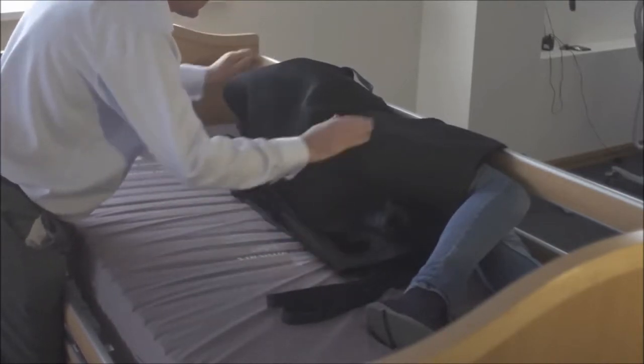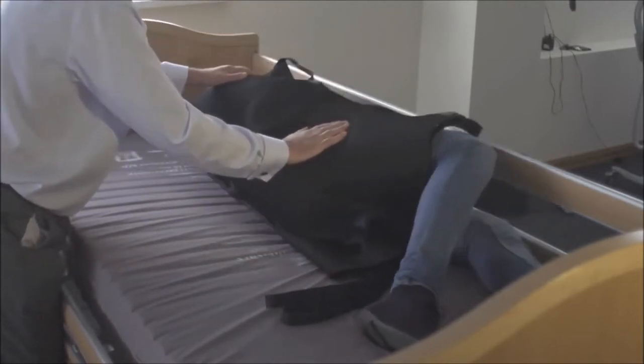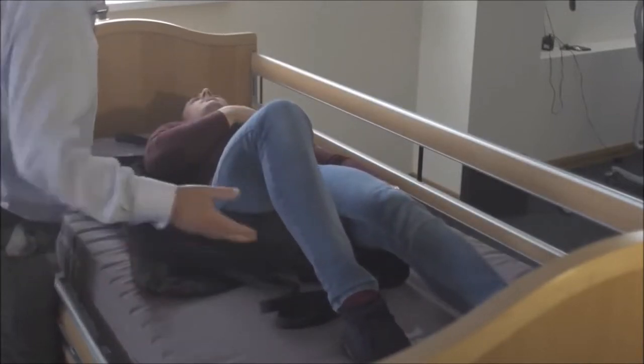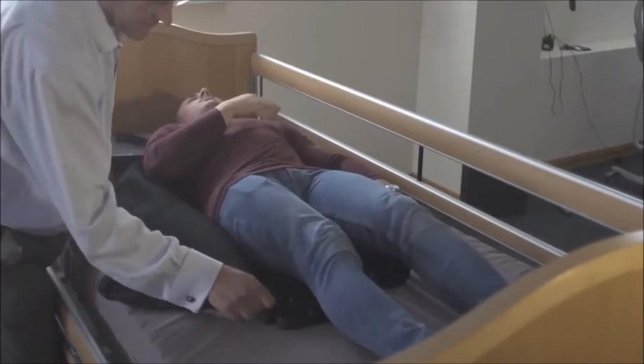And if you would like to come onto your back, keep your hands on the sling so we don't lose the position of the sling — that's excellent. Okay, and if you let that leg down now, that's lovely.